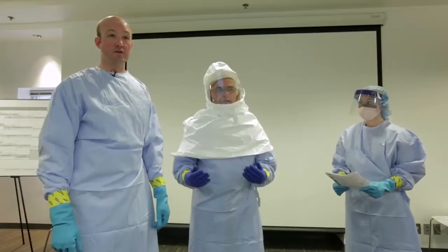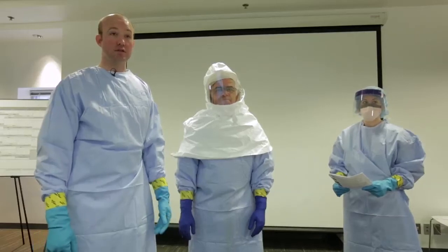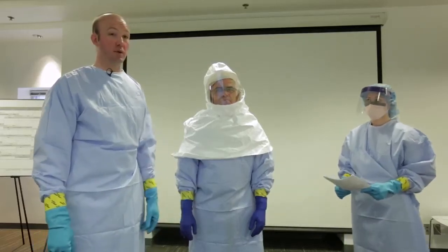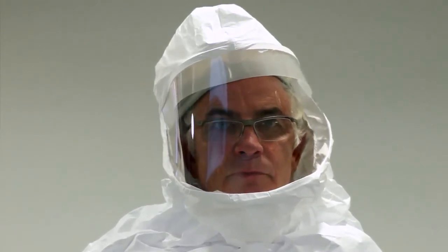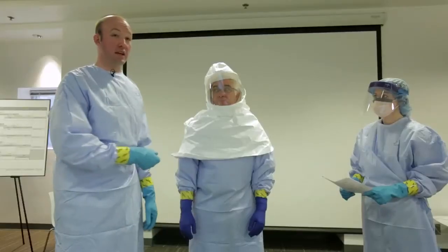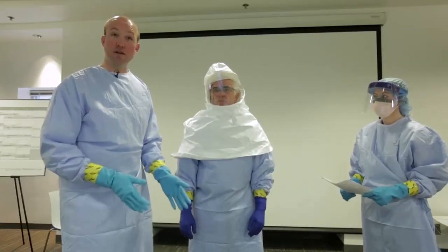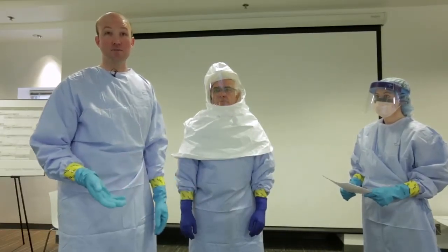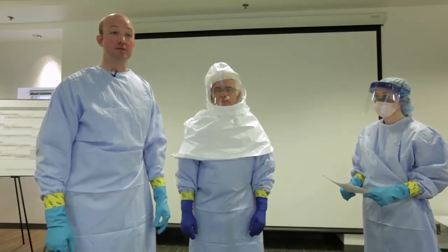Dr. Cleveland is now ready to walk in and treat the suspect Ebola case while we're waiting for state and county public health departments as well as the legacy response team to be deployed to rule out the case, decide to transfer the case, or make decisions from there. Our interest is to get them operational but highly protected as soon as possible so that they can isolate the patient and provide patient care while the rest of the team mounts and sets up a larger response.